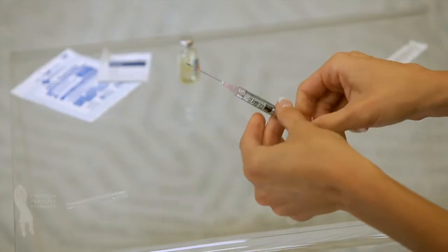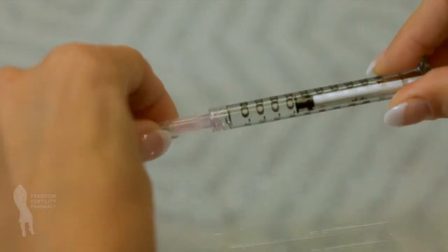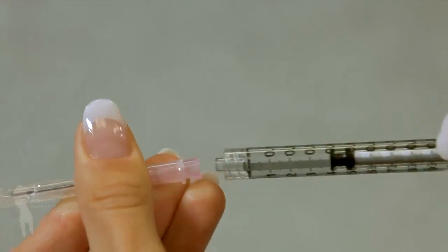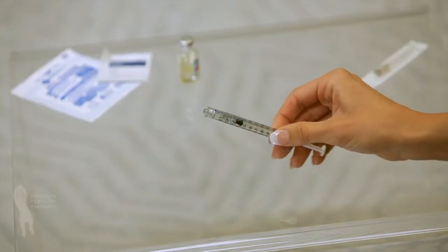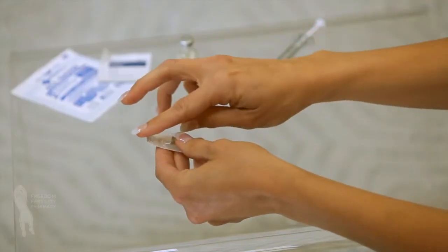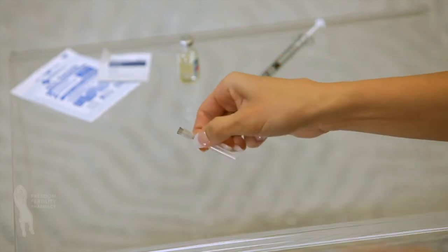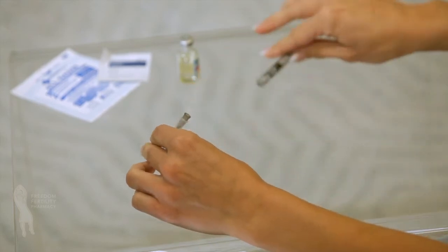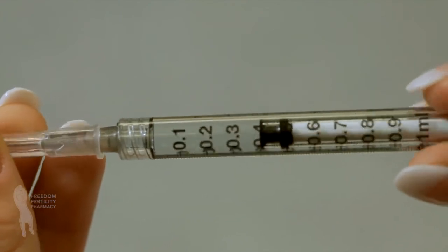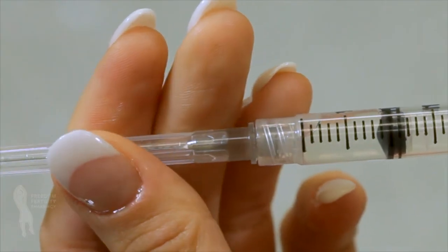Recap the drawing needle by picking up the cap with the needle first, then attaching. Remove the needle by twisting it off the syringe. Discard used needle in your safety container. Remove the wrapping from the long administration needle. Twist the administration needle onto the syringe. Carefully pull or twist off the protective needle cap.